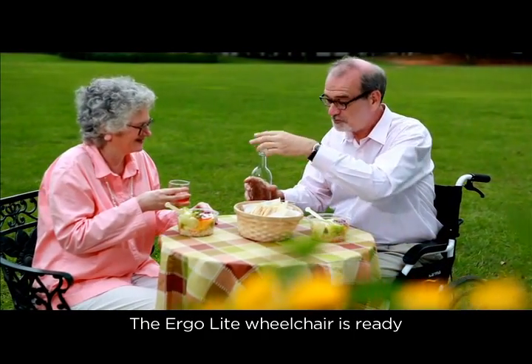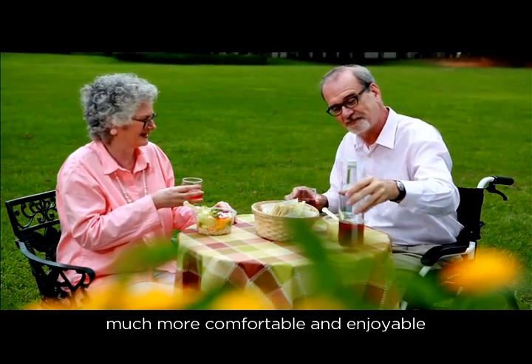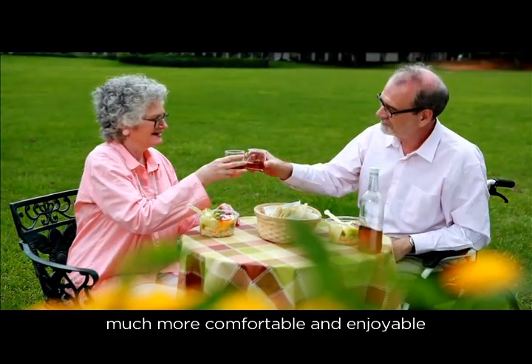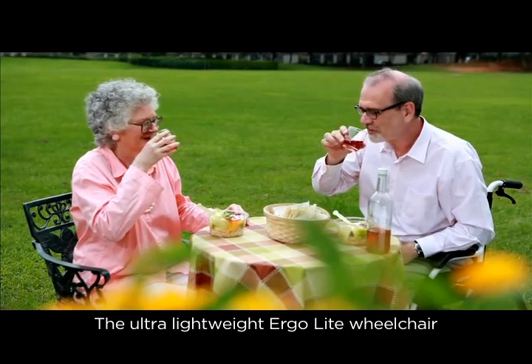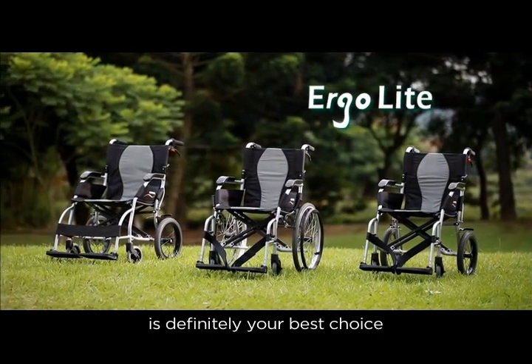The Ergolite wheelchair is ready to make your life experience much more comfortable and enjoyable. The ultra-lightweight Ergolite wheelchair is definitely your best choice.